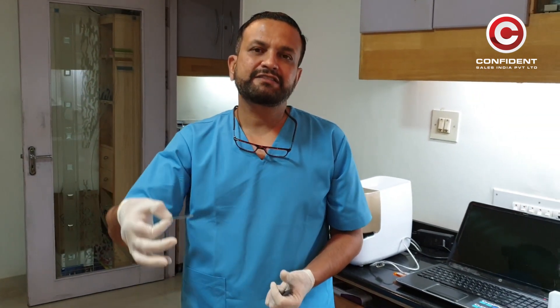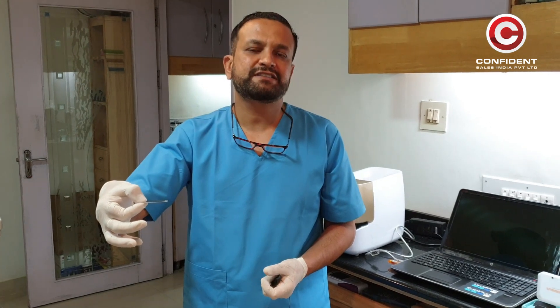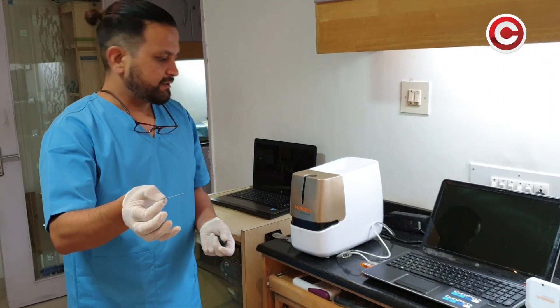The patient hands it over to the dentist. So the cross-contamination that could happen because of the contamination of the saliva is completely prevented. The dentist then carries this on to the plate.